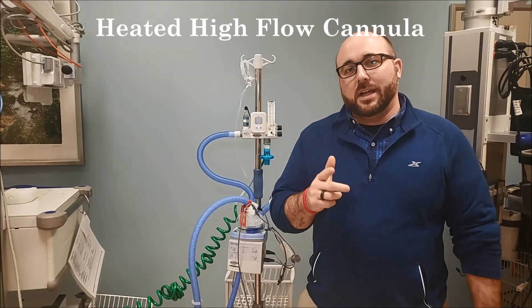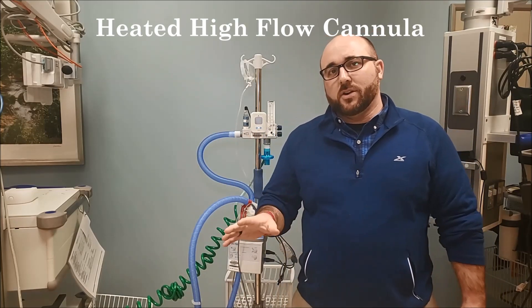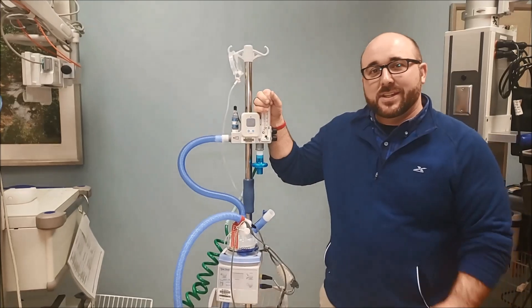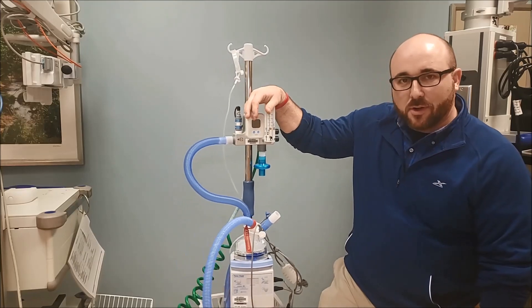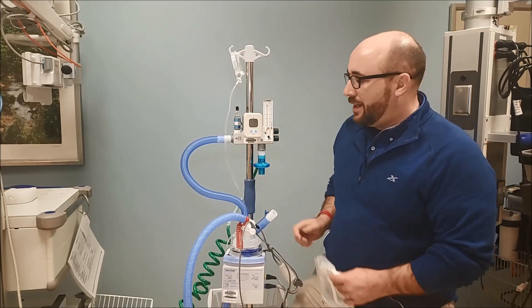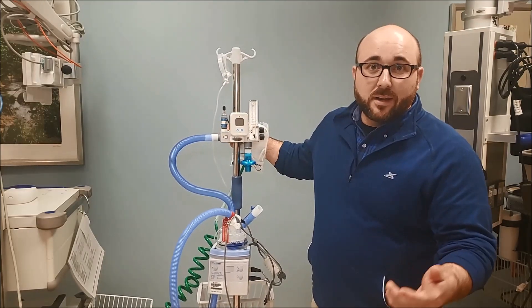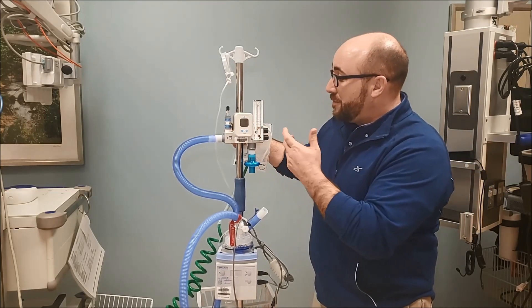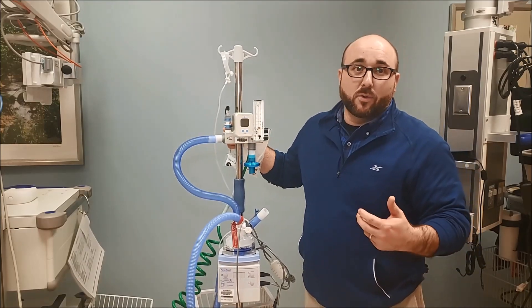Welcome back to the RT clinic. Today I'm going to show you a little bit about a device we're using a lot here in the hospital. This is our heated high flow cannula — the Max Venturi, made by Max Tech. Generically it's known as a heated high flow cannula. Our standard cannula delivers flows up to 6 liters per minute; high flow cannulas go up to 15. This cannula actually delivers anywhere from 20 up to 60 liters per minute.